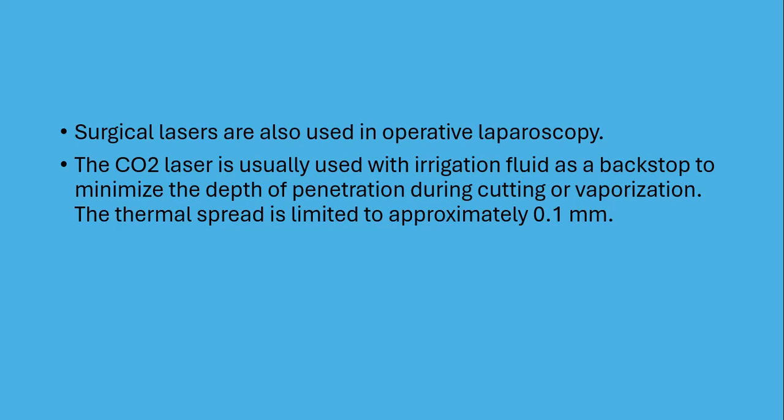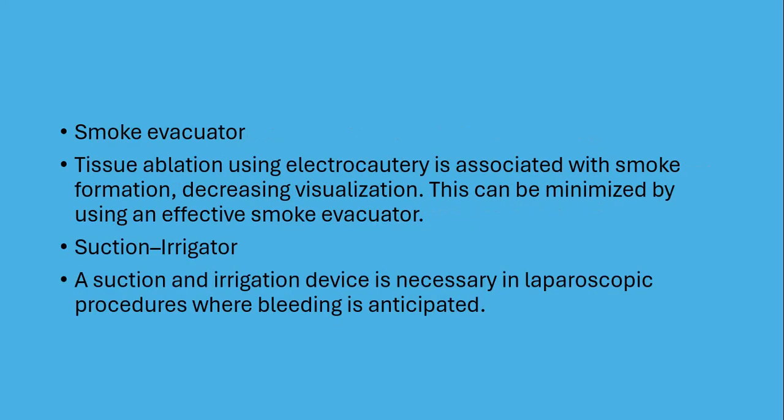Surgical lasers are also used in operative laparoscopy. The CO2 laser is usually used with irrigation fluid as a backstop to minimize the depth of penetration during cutting or vaporization. The thermal spread is limited to approximately 0.1 millimeters.